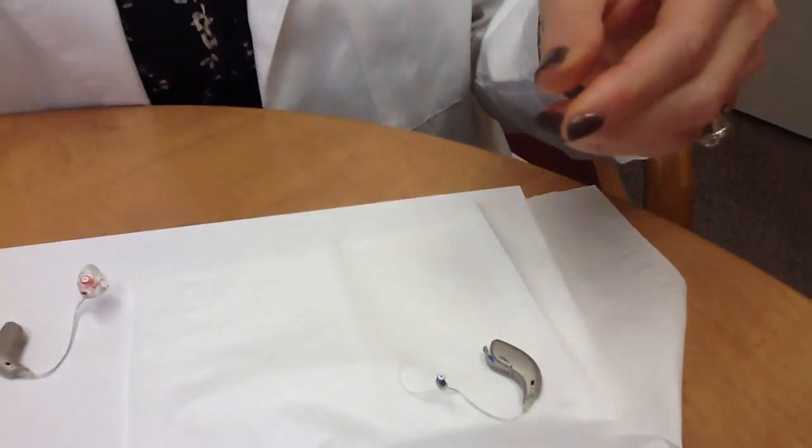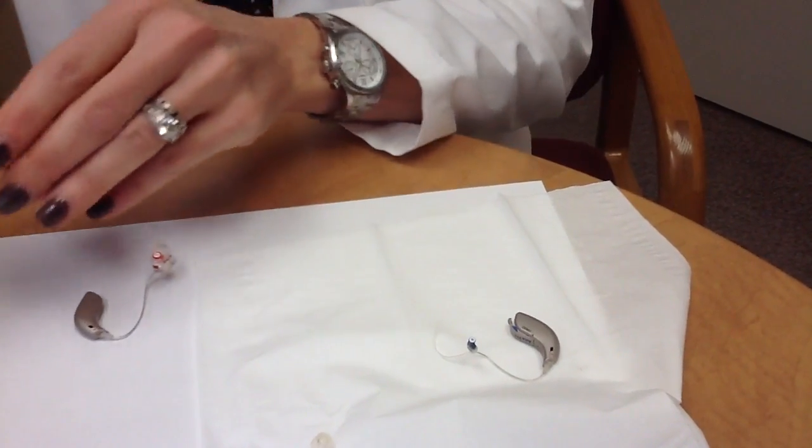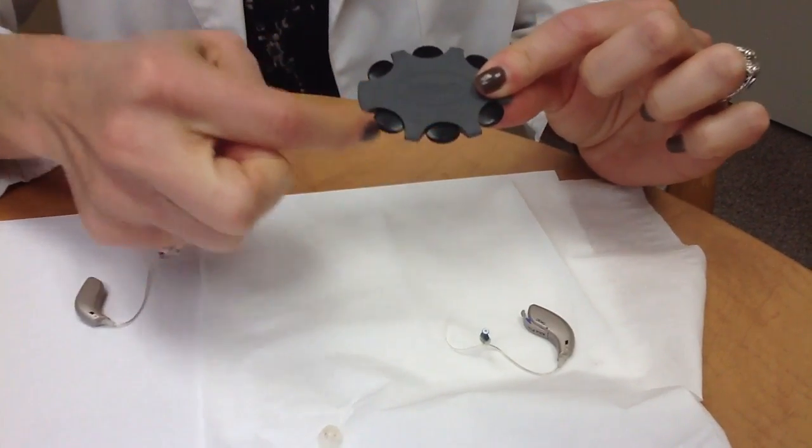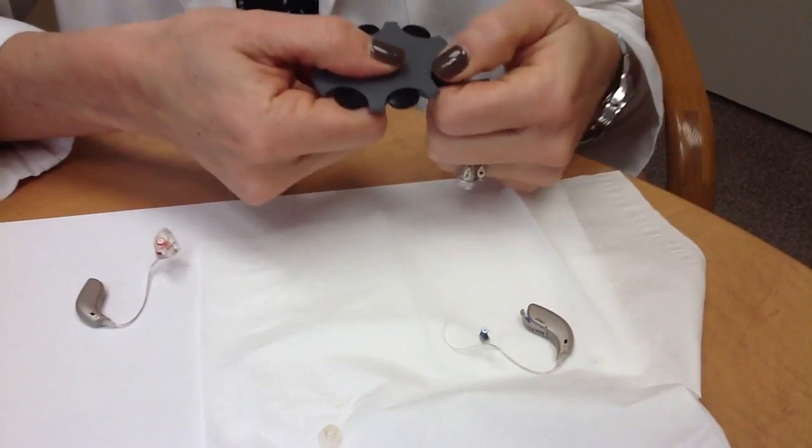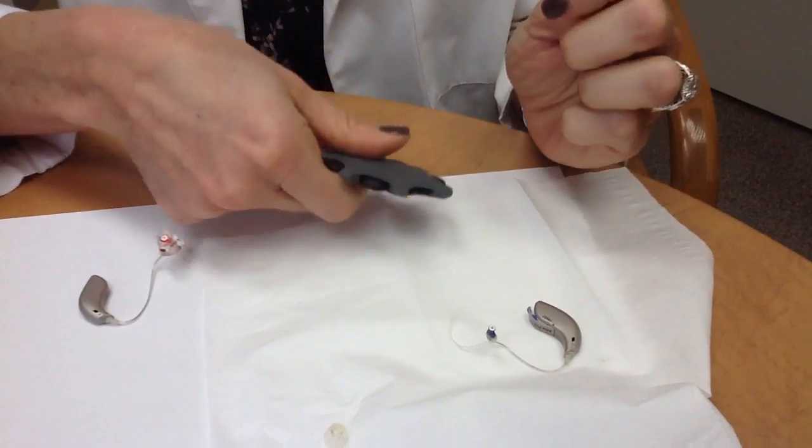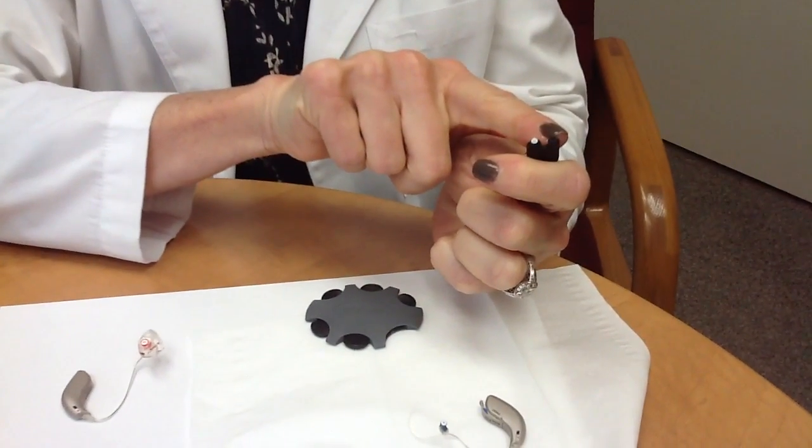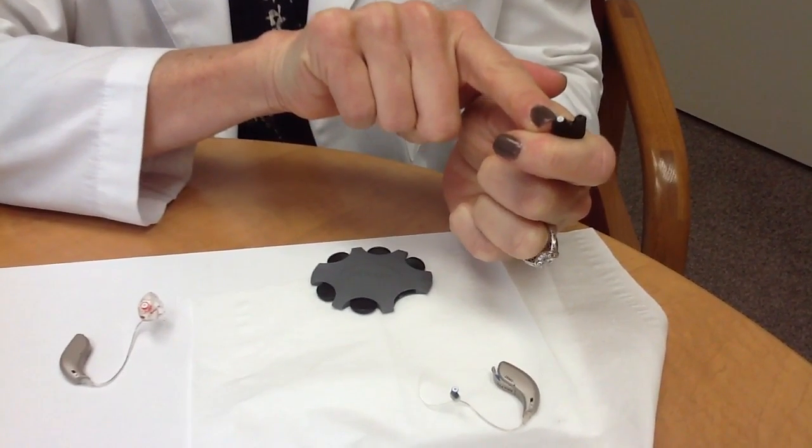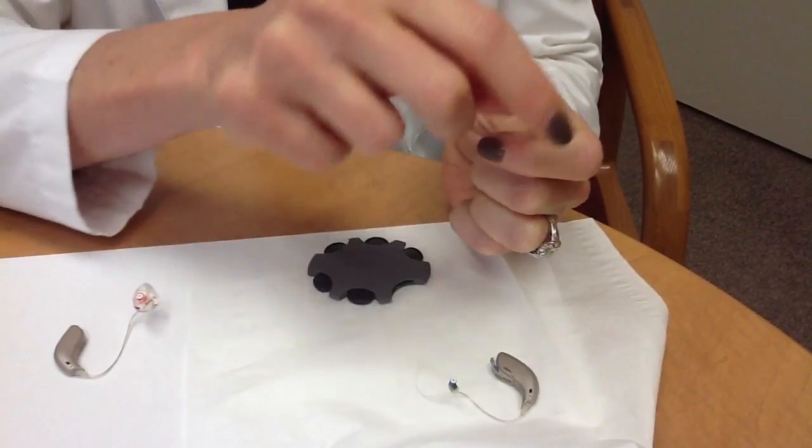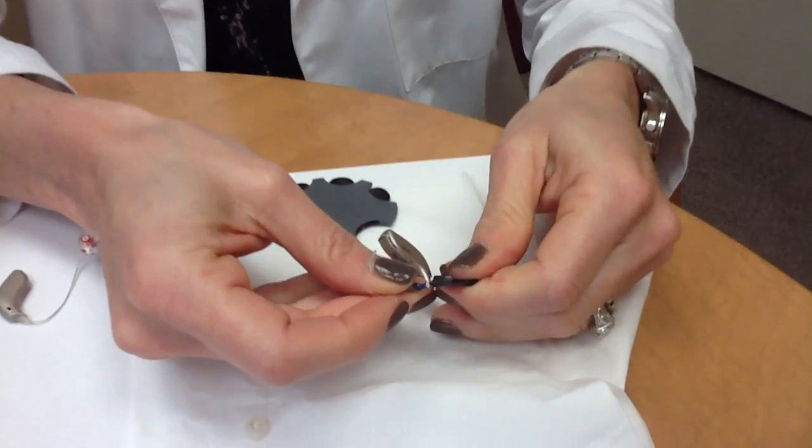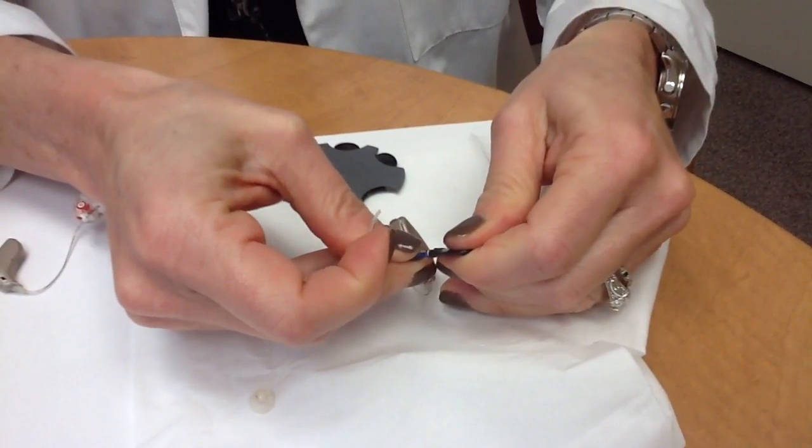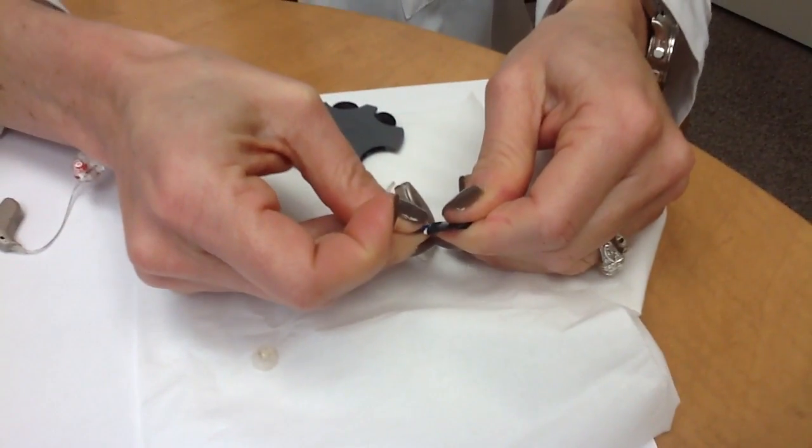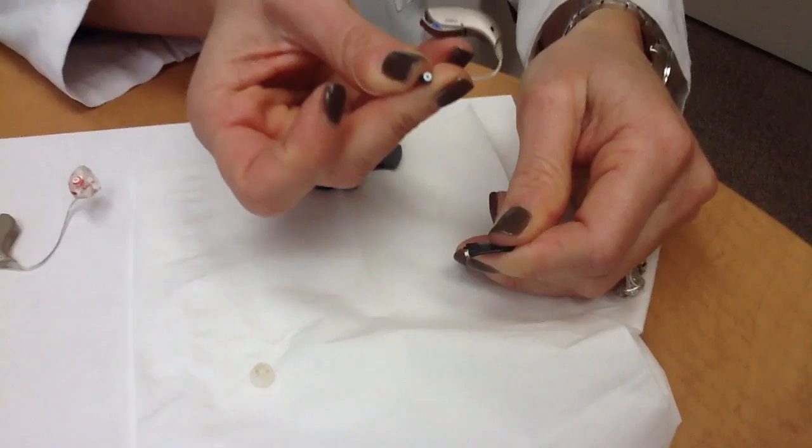For this particular company, the wax guard looks like this. Instead of having sticks, they're like little petals on a flower. Each petal has a removal side and a new wax guard. Again, to take the old one out, you use the removal side and simply push in and pull out. Then you move to the new one, push in and pull out, and it stays.